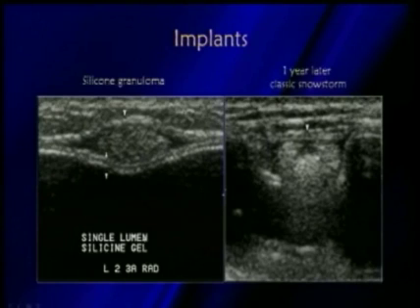This is a patient that came in who had recently had implants put in. You can see this is actually her capsule through here. This is the body's reaction to the implant. This is the shell, and then we saw this echogenic area separating the capsule from the shell. We weren't sure exactly what we were dealing with. Was this a true lesion or what's going on? We asked her to come back 3 months later for a checkup. She did not come back for a 3-month follow-up.